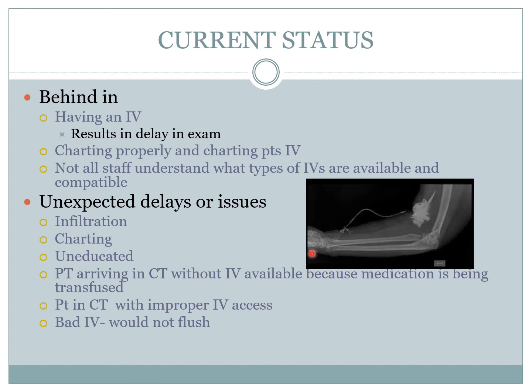And here is another reason of how we can harm the patient more than we need to. So infiltration, extravasations, it happens, and sometimes it's a good IV, but their veins cannot tolerate it. I've seen a lady get poked 20 times, at least 20 times, not exact, I wasn't counting, but at least 20 times all over.